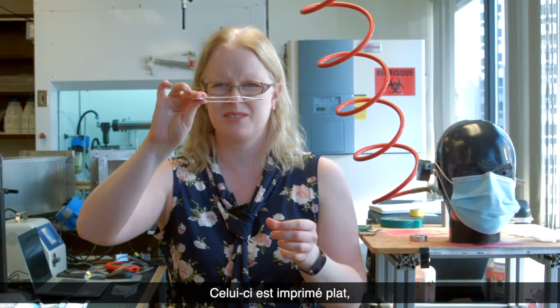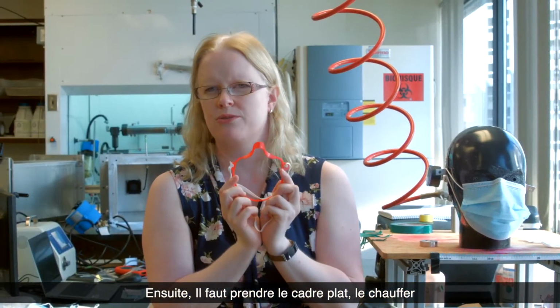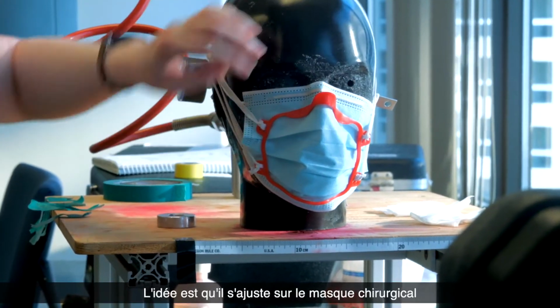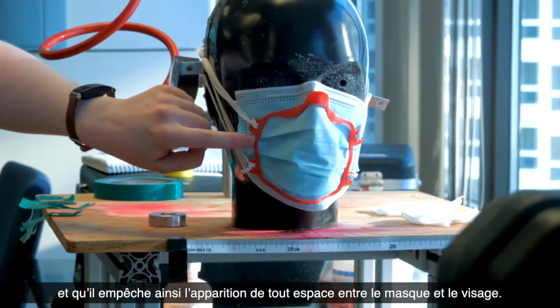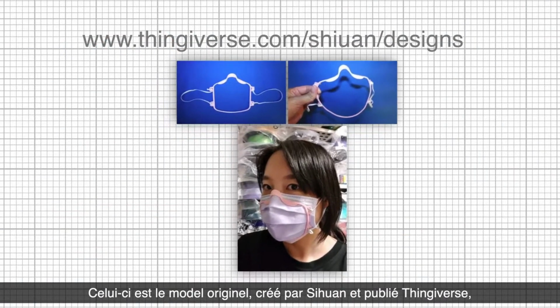So basically the mask frames are printed flat, which for 3D printing is a much faster process. And then what we do is you take the flat frame and you heat it up and you put it on your face and you mold it to your face. The idea is that it fits over the surgical mask, and so that it prevents any gaps between the mask and the face. Now this is the original model that was designed by Xuan on Thingiverse.